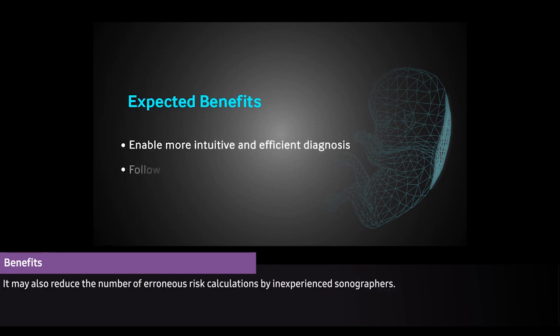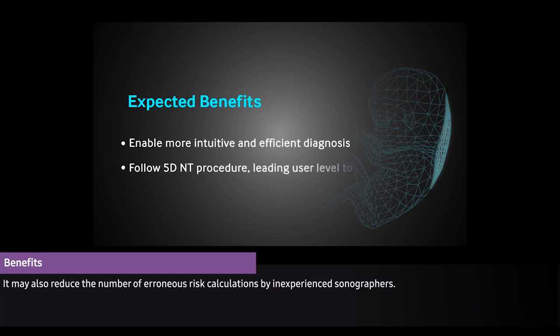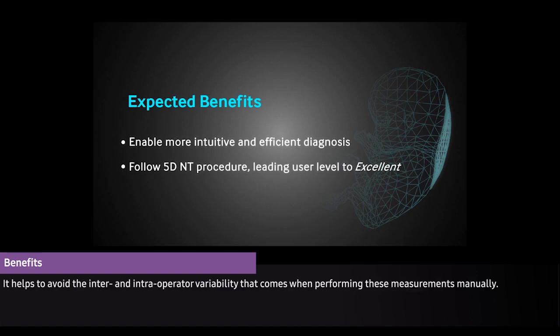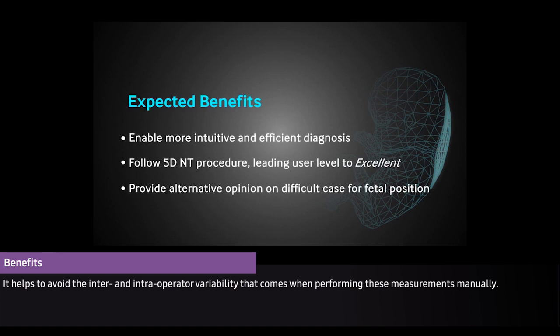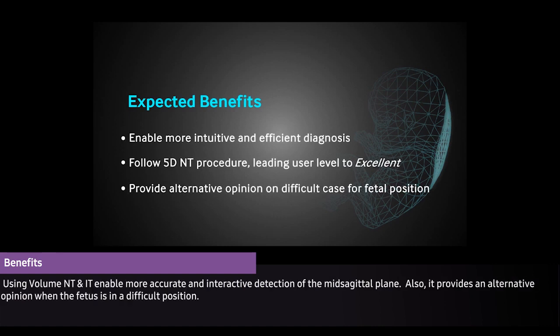It may also reduce the number of erroneous risk calculations by inexperienced sonographers. It helps to avoid the inter- and intra-operator variability that comes when performing these measurements manually. Using volume NT and IT enable more accurate and interactive detection of the mid-sagittal plane. Also, it provides an alternative opinion when the fetus is in a difficult position.